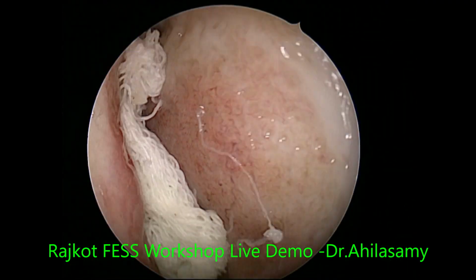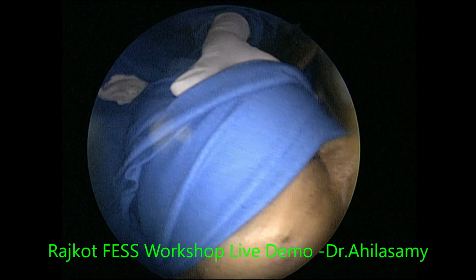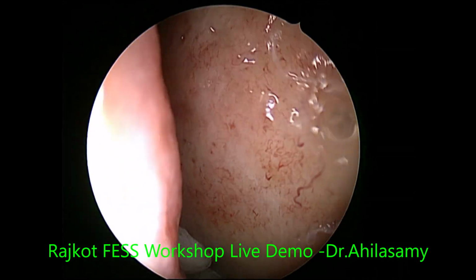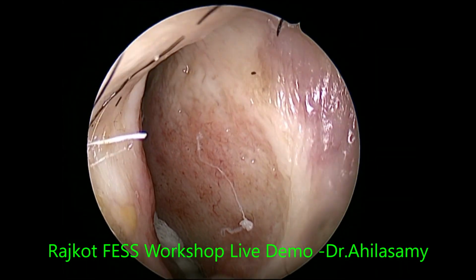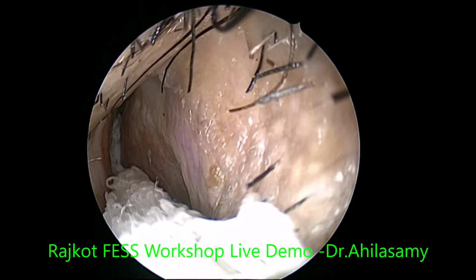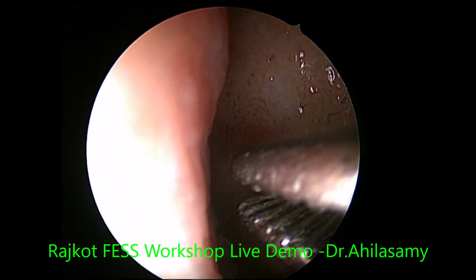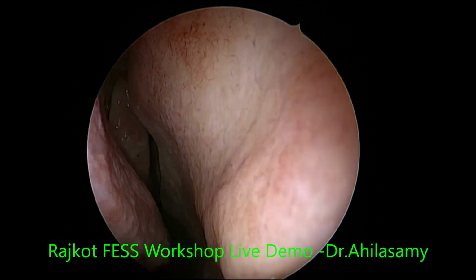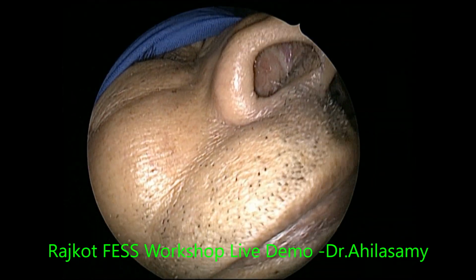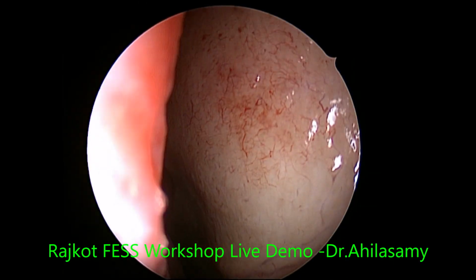Now let's see how much space we have harvested. BP, got it? Please. So now the pulse is around 70. BP is 137 by 75. The patient is a 75-year-old man. He can't be sedated much. He has post-CABG. The septum is still bad. As Dr. Tulasi said, whether we have to correct the septum or not.